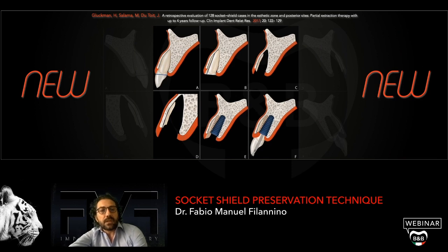I want to start this lecture about the socket shield or partial extraction therapy with this article that marked my time zero with this technique. It was May 2018 when I went to Milan to a daily course with Owe Gluckman, invited by Dr. Marco De Gidi.